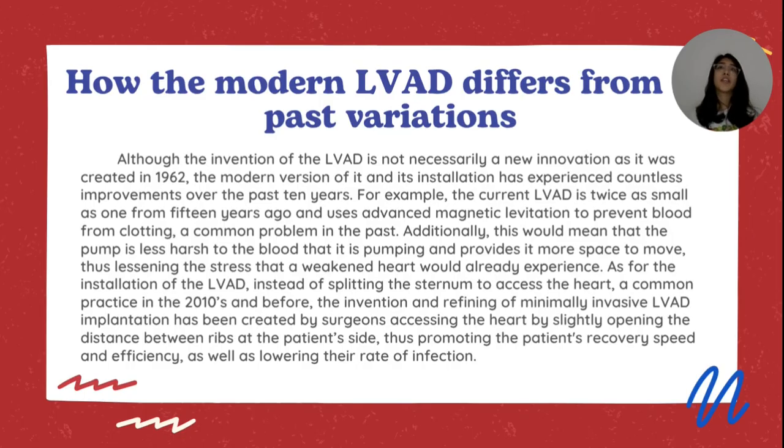Additionally, the way that the LVAD can be implemented now is through minimally invasive surgery, in which instead of surgeons accessing the heart through the sternum, right between these ribs, they would instead go from the side of the patient and between the distance between those two ribs. And because of that, this would be promoting the patient's recovery speed as well as its efficiency, as well as lowering the patient's rate of infection.